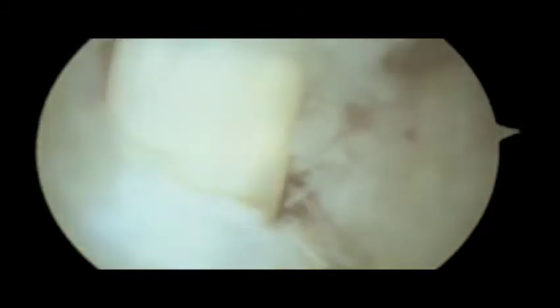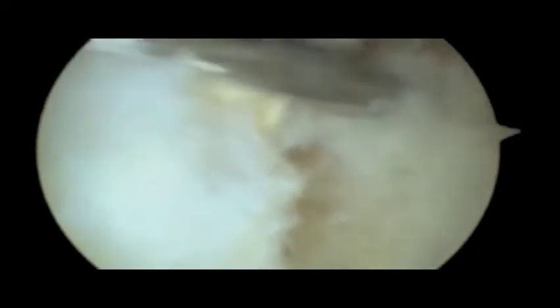Imaging can be used to confirm wire placement, but the intention is to place this directly onto the ligament footprints. The guide wire is then inserted aiming posteriorly, and this is then drilled over, taking care to protect the peroneal tendons.